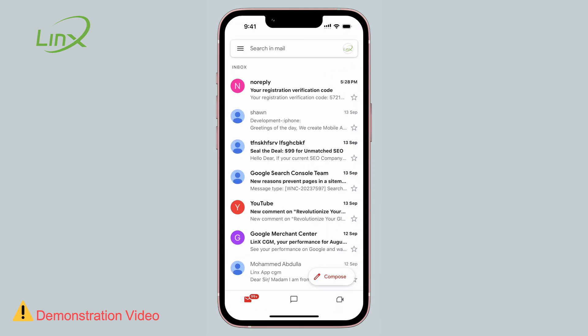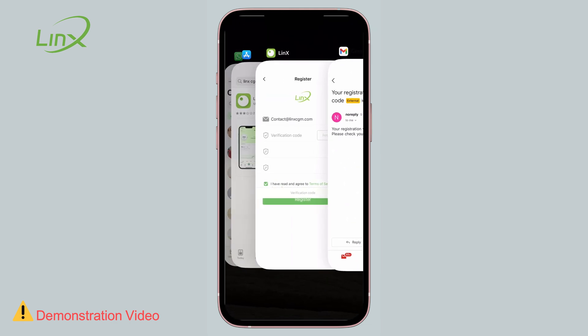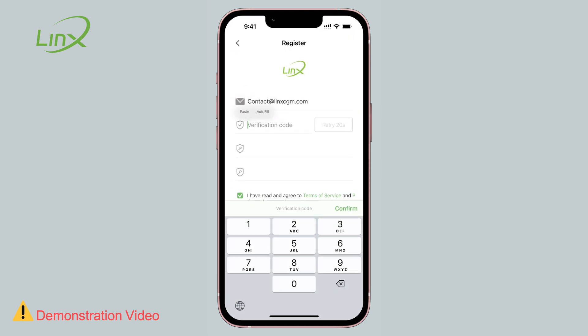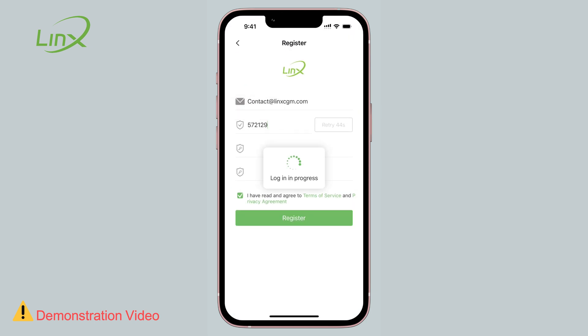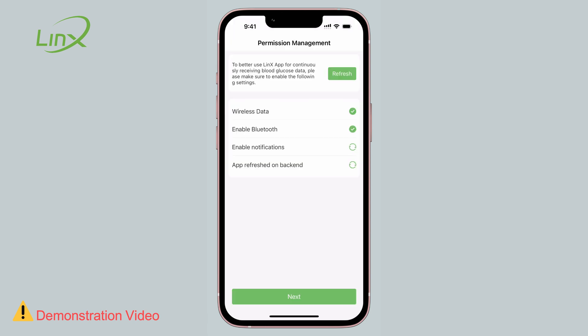Check your email to retrieve the verification code and then enter it into the app within 60 seconds. Now you can log into the app and it will prompt you to select the preferred measuring unit, either in millimoles per liter or milligrams per deciliter.